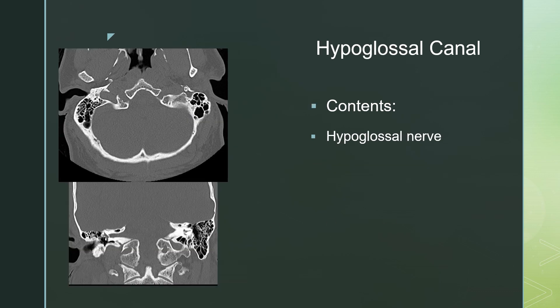The hypoglossal canal contains the hypoglossal nerve. To find this, you look for the level of the clivus, then look for the jugular fossa — the hypoglossal canal is that opening in the bone between the clivus and the jugular fossa. Here's the right hypoglossal canal, the left hypoglossal canal, and on coronal imaging, here is that bony canal at the level of the skull base on the right and on the left.